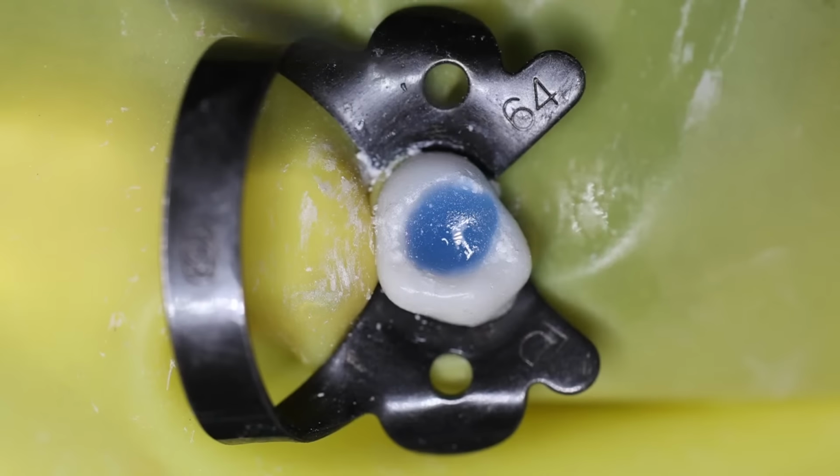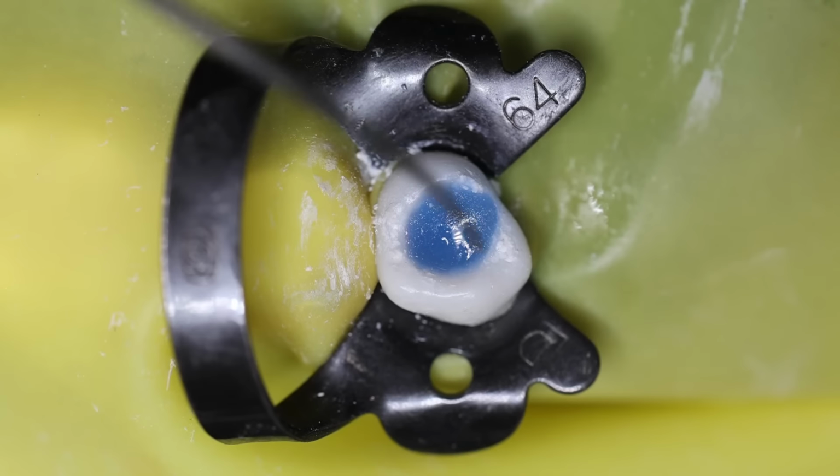So this was the demonstration of pulpotomy, MTA pulpotomy, which is done in 2 sittings. After 48 hours we do this restorative part, and before that we did the MTA part. So this was all about this. If you have any queries, you can definitely ask me. Hope you understood well. Thanks.